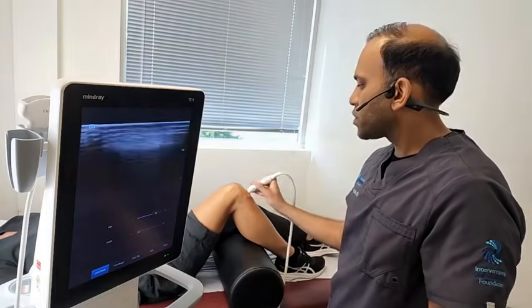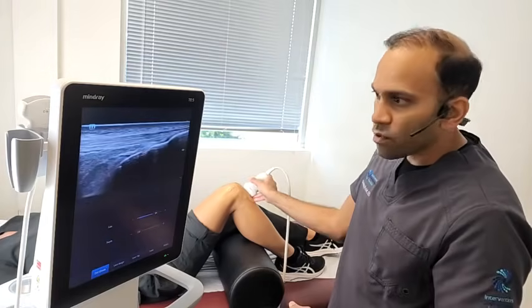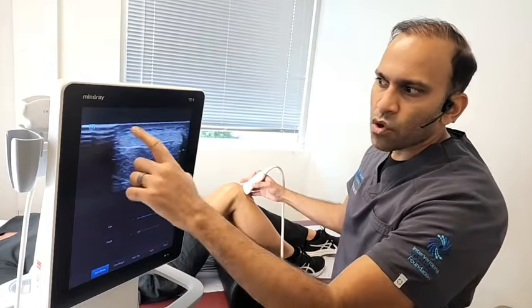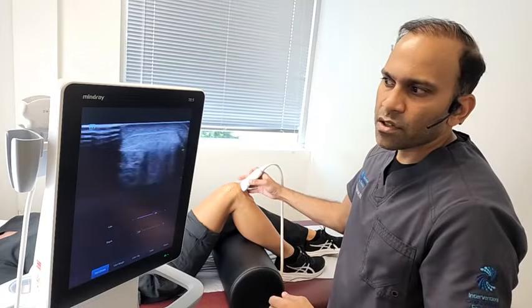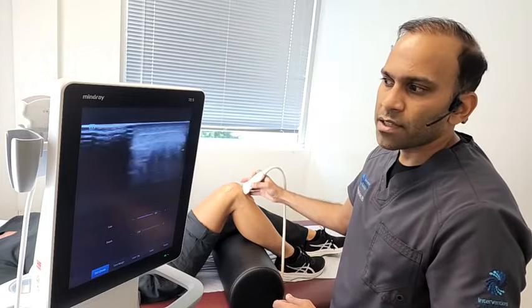Now I'm going to look at this tendon in cross section here. So I changed the orientation of my probe from here to here, and this is now looking at this tendon in cross section. So this almost oval-like structure is the tendon here. You can see what a nice, beautiful tendon looks like. Overall, looks really healthy. Can't really complain about this tendon much.